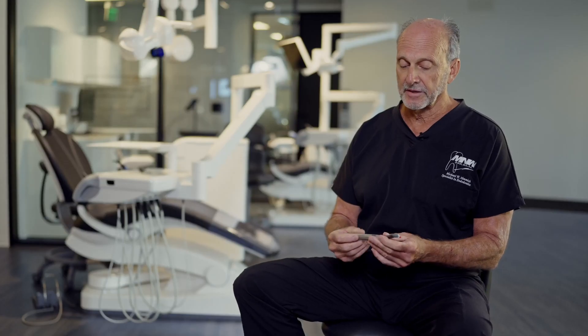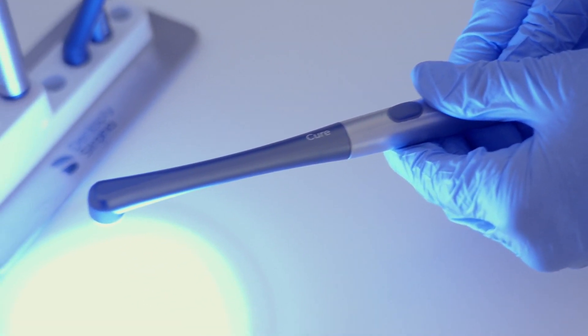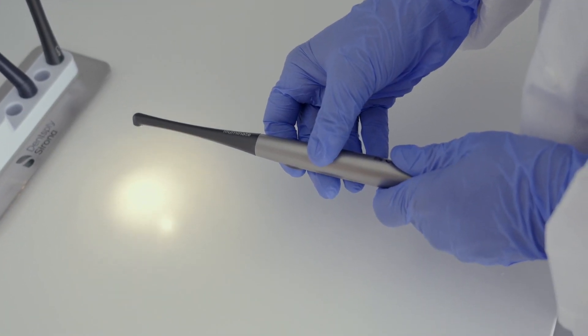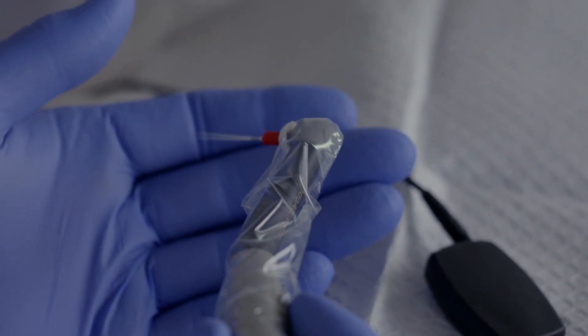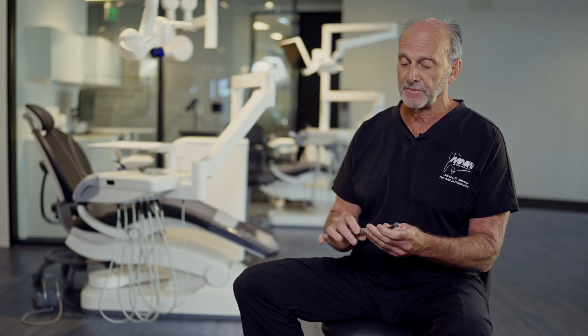Another feature about this product that is really phenomenal — and it cleans up my operatory and tray setups — is that it actually comes with a different head. You can put a curing light into it, and you can also use a trans-illumination light along with the endo activator. They can all be stored on a stand elsewhere in your operatory, so the change-out from the curing light to the activator to the trans-illumination makes this really nice.